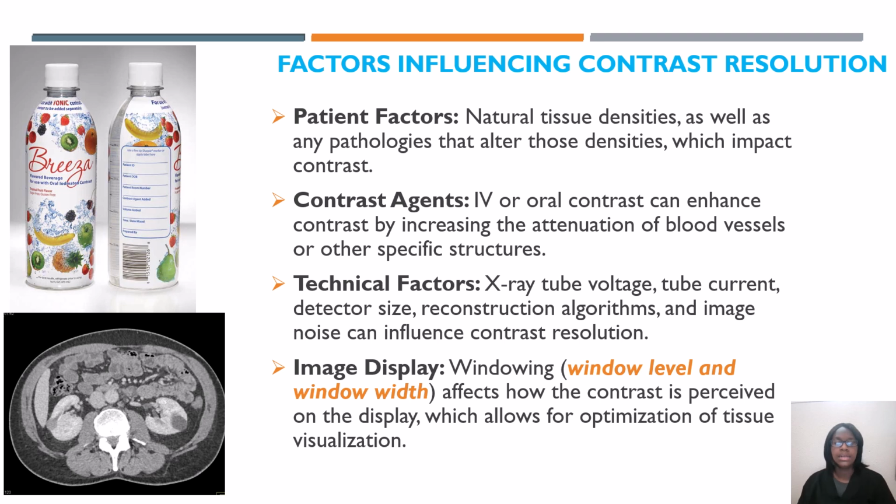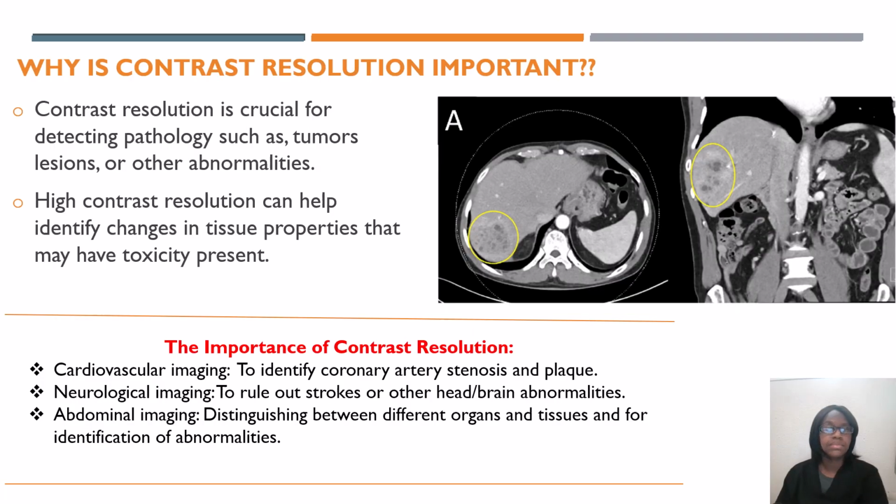So I know whenever I perform CT biopsies, a lot of times I do have to window and level for the radiologist so that they can see the needle and make sure that the needle is where the tumor is at or close to the tumor, making sure that they are in the right area. Also, put in the comment box if you are comfortable with performing biopsies. I do have a video in my CT Registry review playlist if you want to check that out.